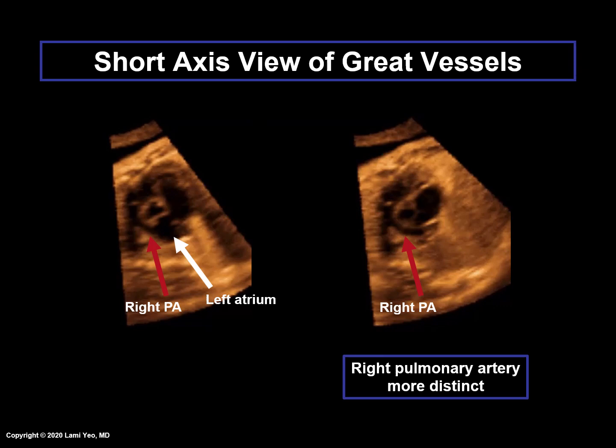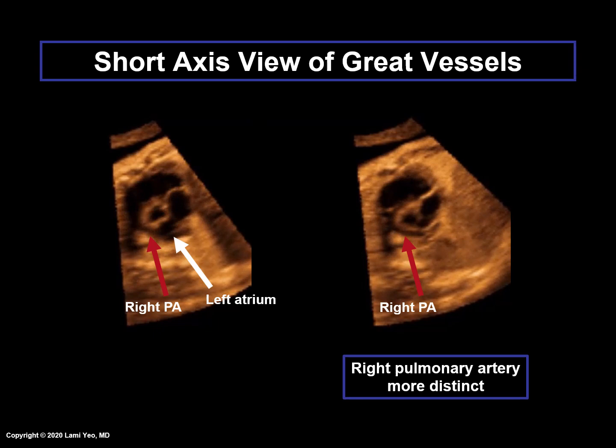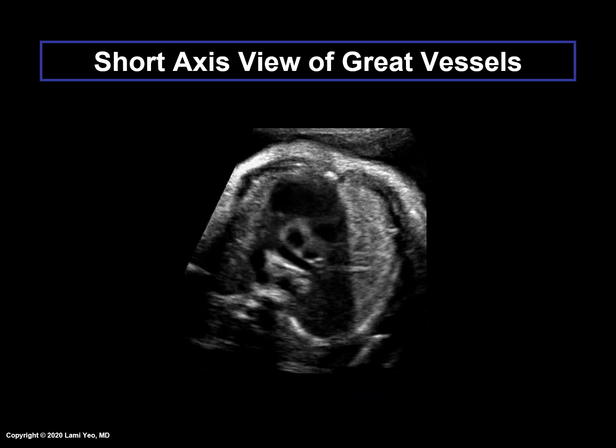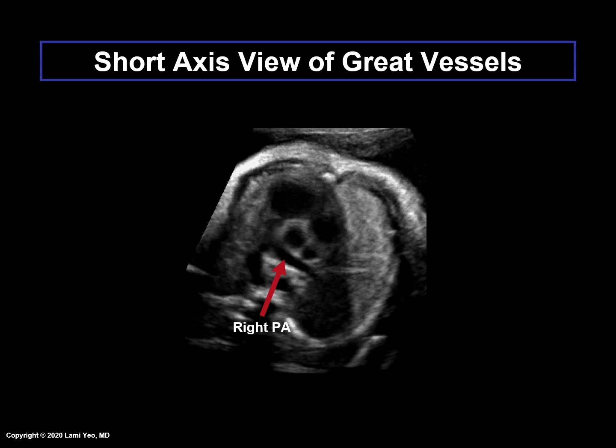Sometimes, in the short-axis view of the great vessels, depending upon the inclination of the transducer, the right pulmonary artery is more distinct, as shown by the red arrow, and the left atrium may not be visible well. Here is another example in which the right pulmonary artery is more distinct, as shown by the red arrow.